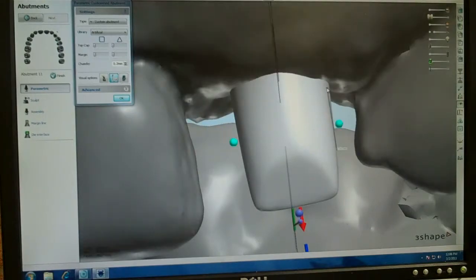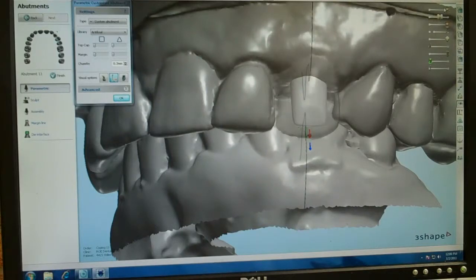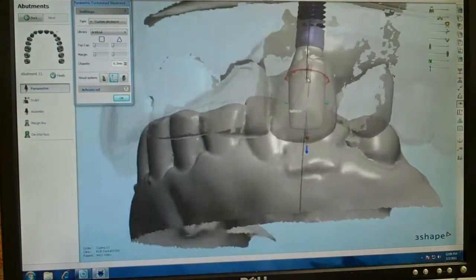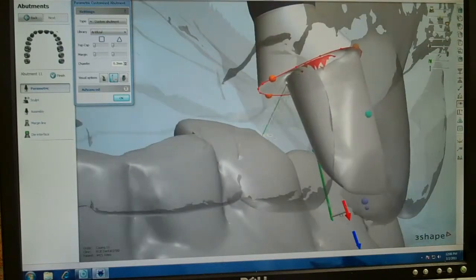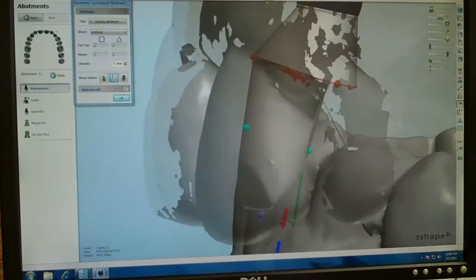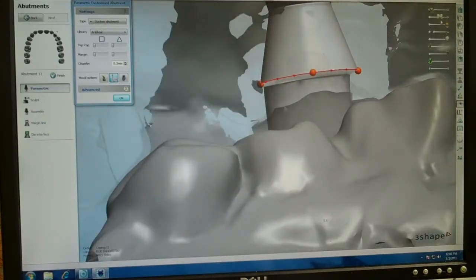Now we're going to check the margin location. Here's the tissue, and on an anterior, if we're using a titanium abutment we want to make sure the metal doesn't show. We're going to go about two millimeters subgingival, no more. Each box on this grid represents a millimeter, so we are just about two millimeters subgingival. The proximal is just about the same — not quite two millimeters.